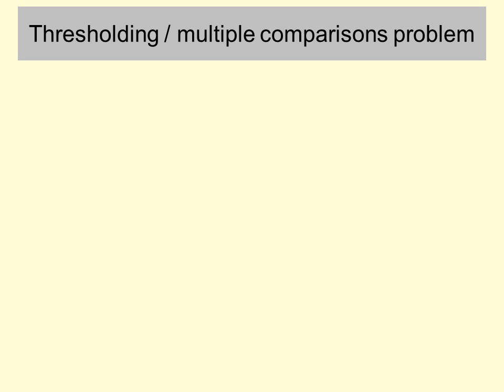It's common at this point in an introductory fMRI lecture to talk about the multiple comparisons problem, which, as I may have mentioned in the first week, is the problem of determining the actual p-value of the t statistic or z statistic at each voxel, given the need to take account of the fact that you're doing lots of comparisons, and that if you just use an uncorrected alpha of something like 0.05, you'll have a lot of false positives. Anyway, I shall be talking about this in detail in week 4 or 5, so I'm just going to skip this for now.